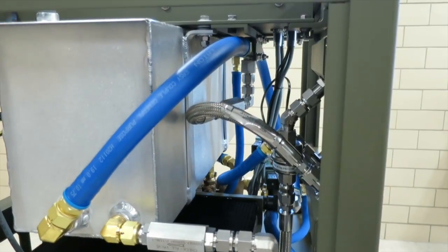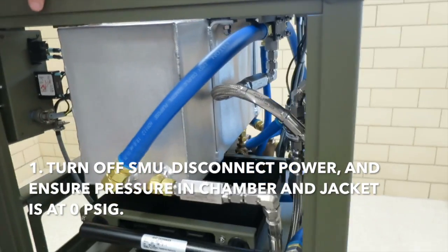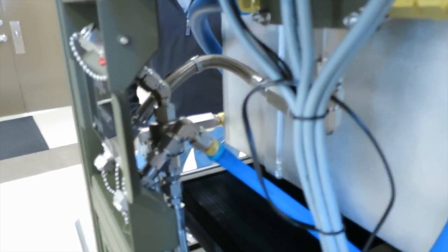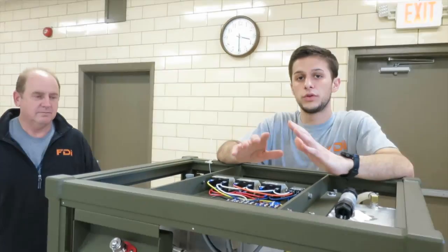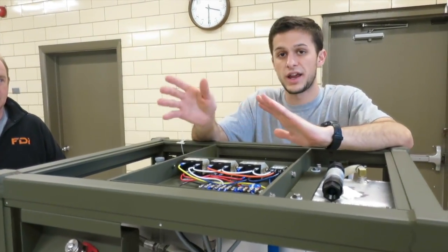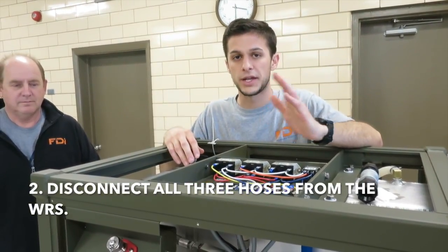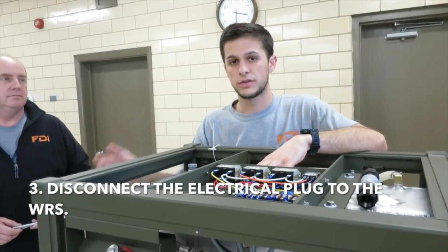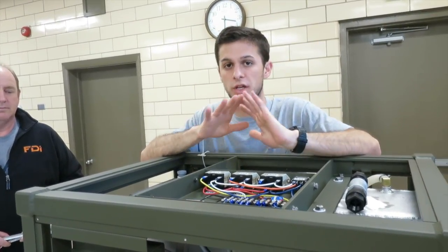So first step, you're going to turn off the SMU and disconnect all the power, and we've already done that. For this video, we've completely disconnected this from the SMU. We've taken off all the panels. When you do this on a setup sterilizer, you'll just slide this out, disconnect 3 hoses, and make sure power's disconnected so you're safe from any electrical shock. And you're really going to want it to cool down. The steam trap gets very hot, so you want it to be cool.